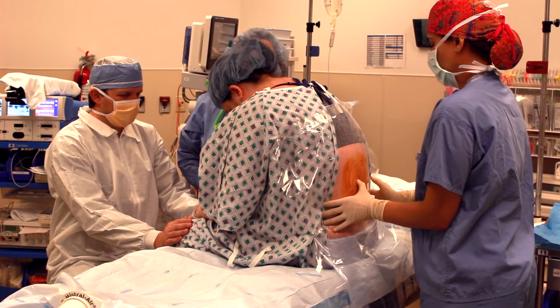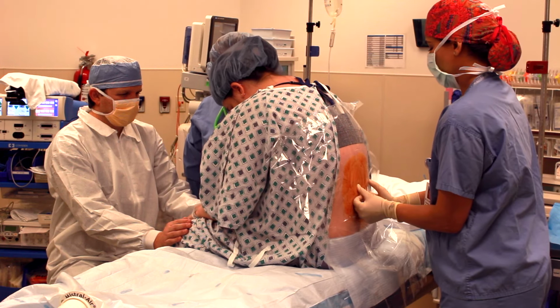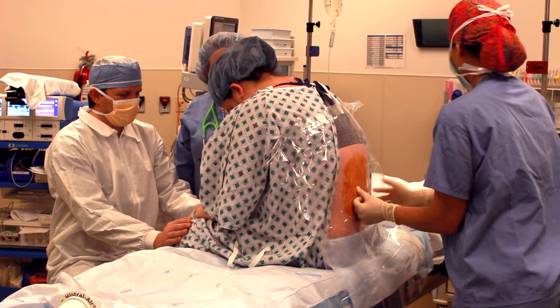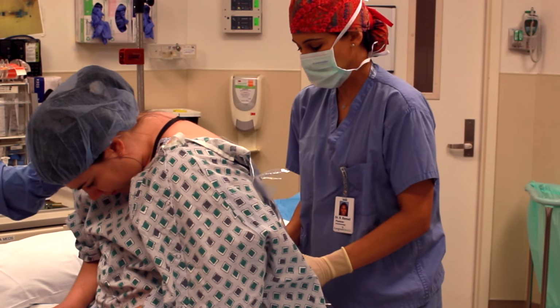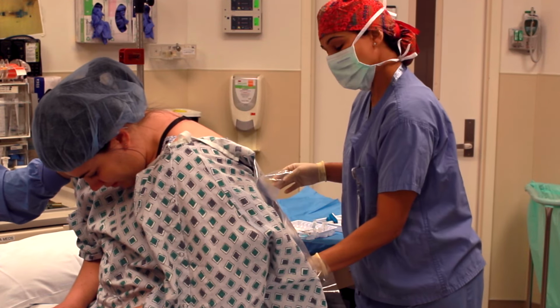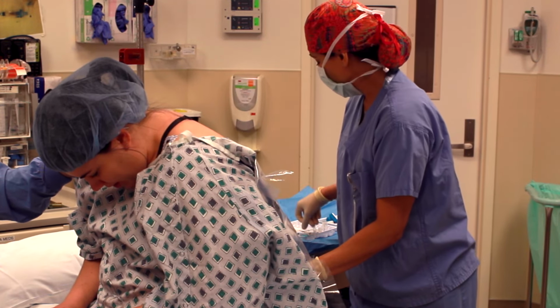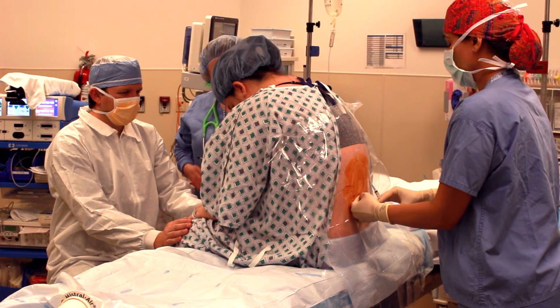Okay? And I'm going to do a little bit more feeling just to find the right spot. Like this? That looks great. Try to keep it in that position. Where you feel my finger, I want you to push against that. Perfect. This first part of the procedure is the worst part. It's going to help the rest of the procedure go a lot more smoothly. It's the numbing medicine, okay? Okay, on the count of 3.